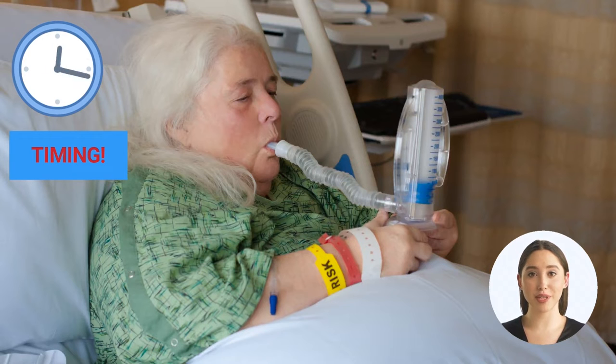Be sure to ask the patient if this is the first time they are using an incentive spirometer. If the patient says they are familiar with it, ask them if they have any questions they would like to review prior to using the apparatus. An example of how to address knowledge gaps is to have the patient demonstrate how to use an incentive spirometer.